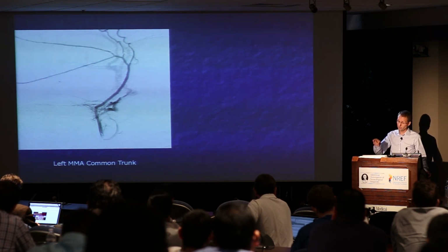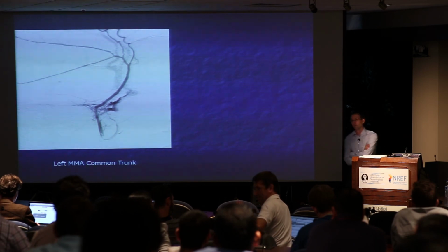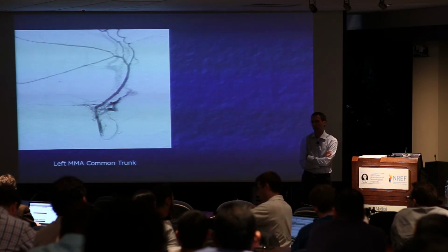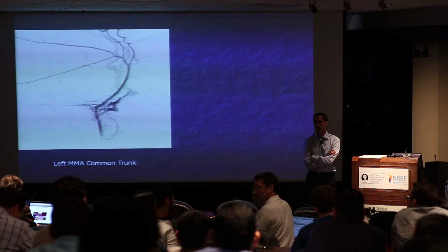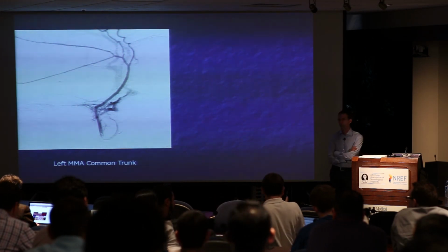It's part of the thunder, right? That, my partner and I, once we acquire this data, we scrub out, we sit down, we go over this in sort of great detail before we decide where we're going to attack it. So along the same lines, I just want to re-emphasize this point. And the way we do this is we always do an angiographic study first. Period. Finish it, then we sit down with a plan, and then we start attacking the problem like that. This is the single most complicated thing you will see in your practice. Right. Do you agree? I agree, 100%.